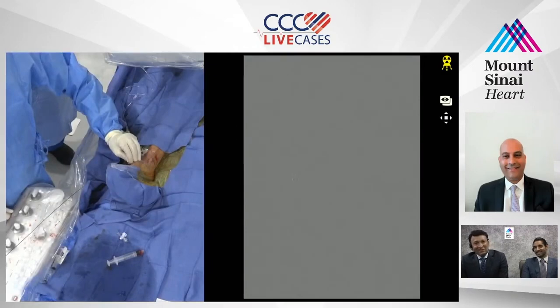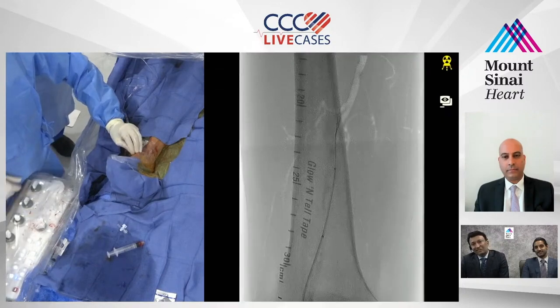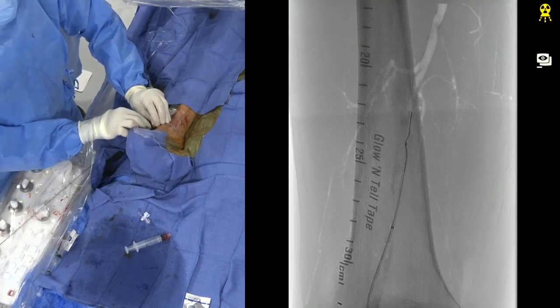I don't want to hear that word, DVA. That's way outside of... Mm-hmm. So we're outside the calcium there. We're going to pull this back, and then we're going to try probably in the vein, try to go with another wire here, but track my catheter up. Yeah. Yes.